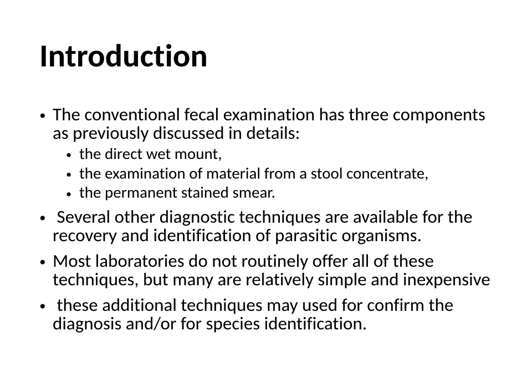In previous chapters, we discussed details about routinely used diagnostic techniques like wet smears, concentration methods, and permanent stained smears. But in this chapter, we will discuss very simple diagnostic methods. Even these methods are not routinely used in diagnostic labs. Most of these techniques are used for confirmatory purposes of certain parasites or for identification of parasitic species.